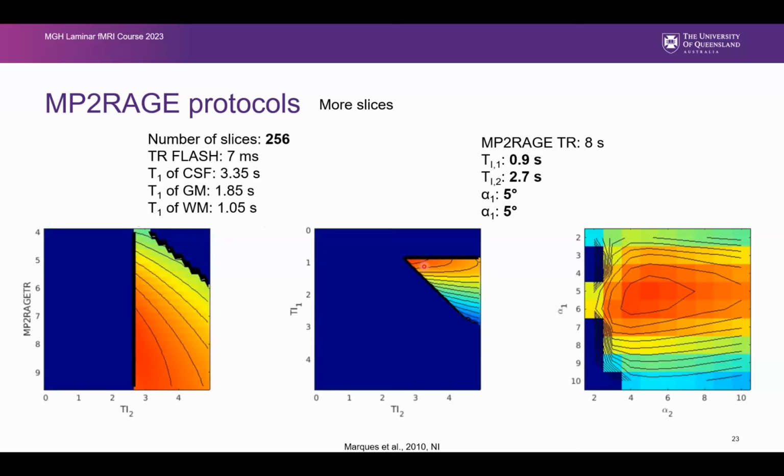Another thing, obviously: if you say, I'm doing high resolution fMRI, I obviously should do high resolution structural imaging. So I'm getting more slices because I'm making them thinner. And again, you can see that all of these parameters change again.